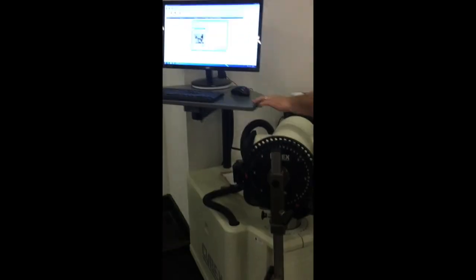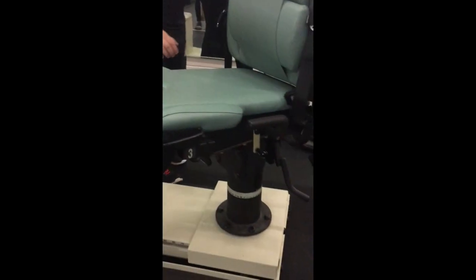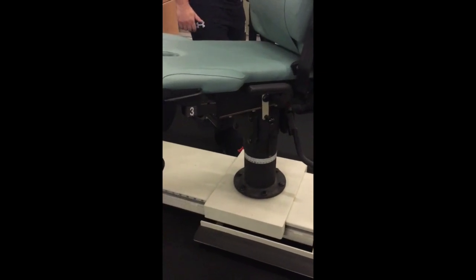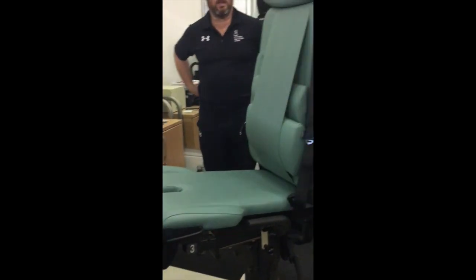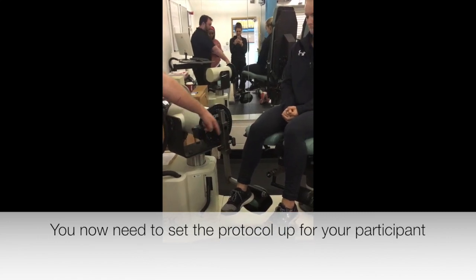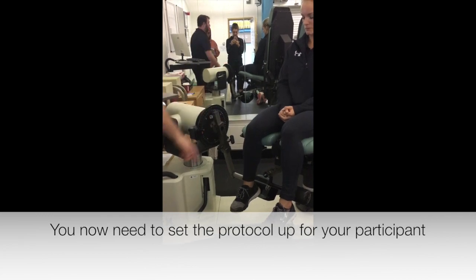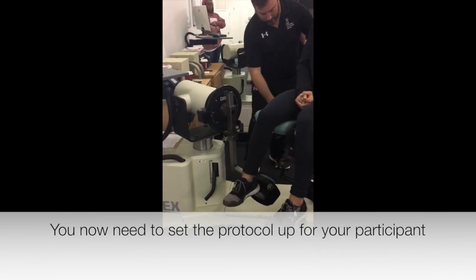The last one you need then, monorail. Okay, which is this one down here. Stand on there. It's 38. Measure it to 38, and there is your setup for a knee. So I will have to move you forward from that fore and aft position, so that they can get a good range of movement on the knee. So if you try and flex your knee now, you can see it's going to butt up against the edge of the seat. So it might be just little changes need to be made.